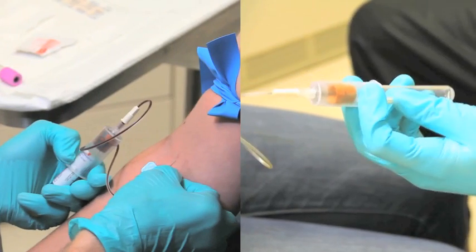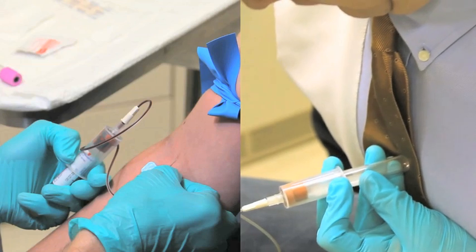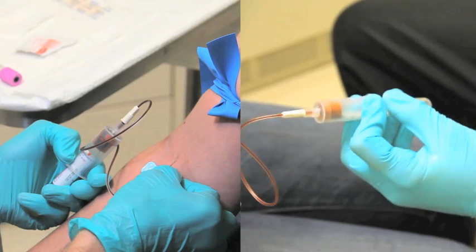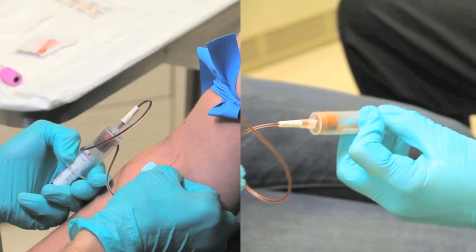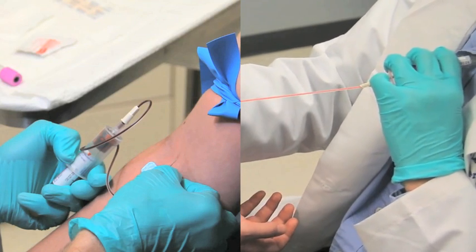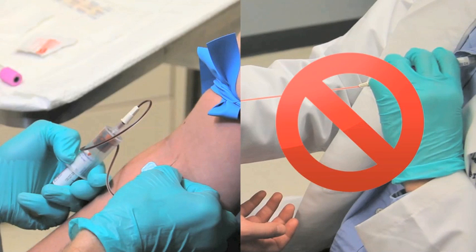You can also press the vacutainer against your chest and force it into the adapter. This requires that you lean forward far enough so that the tubing is not stretched to the point that it puts tension on the needle. Always bring your chest towards the tube and not vice versa. Bringing the tube towards your chest will stretch the tubing and you may inadvertently pull the needle out of the patient's arm.